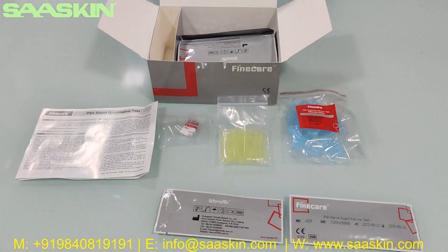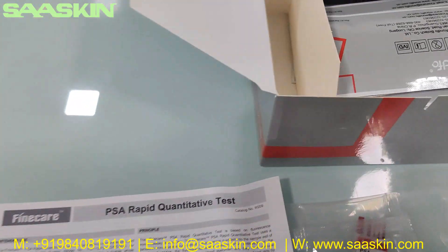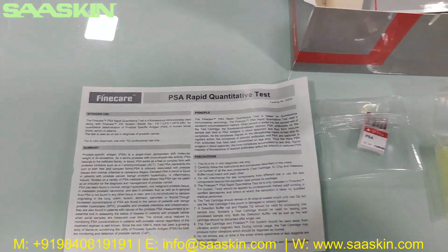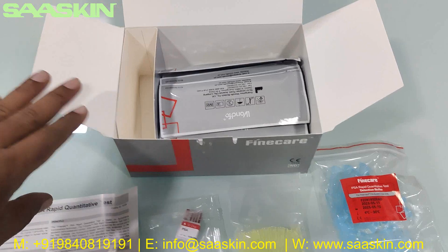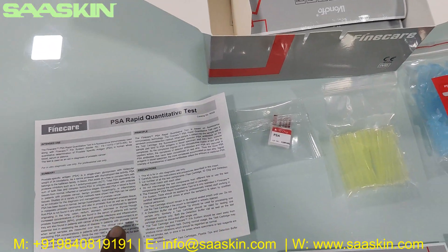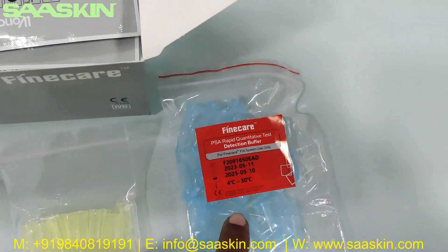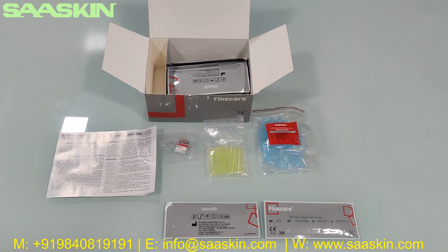Quickly to summarize: today we have seen the unboxing of the FineCare PSA rapid quantitative test, which is used for the prostate specific antigen test. In this 25-test kit pack you get one instruction for use brochure, one ID chip, 25 paper tips, 25 dilution buffers, and 25 test cartridges.